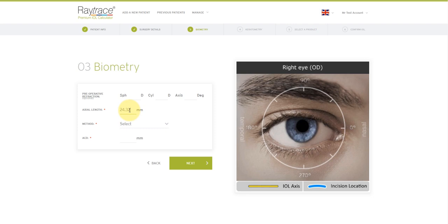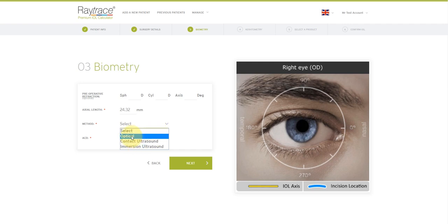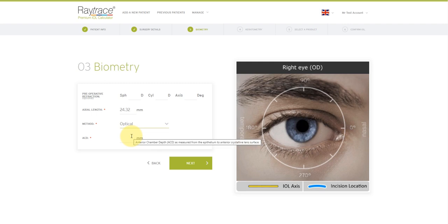For method of biometry, use the dropdown to select from optical, contact ultrasound or immersion ultrasound. We go with optical and then finally add the anterior chamber depth in millimeters.